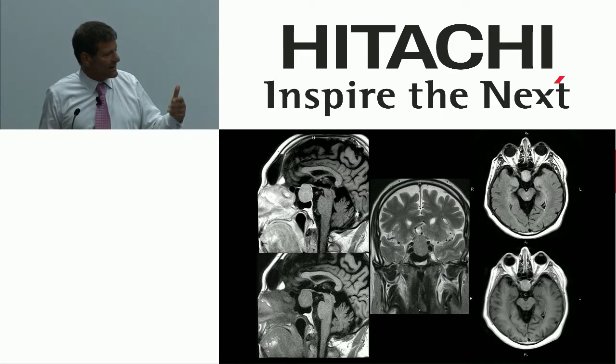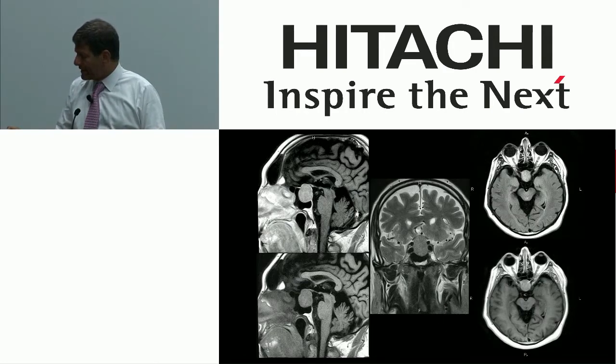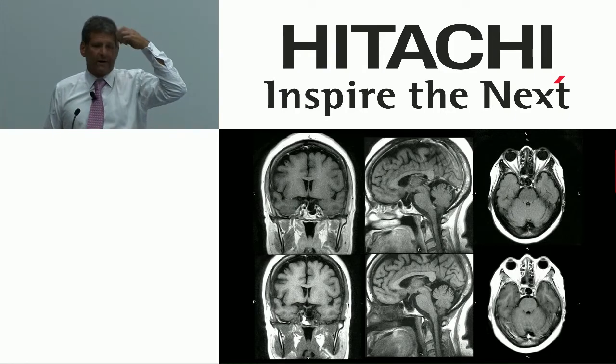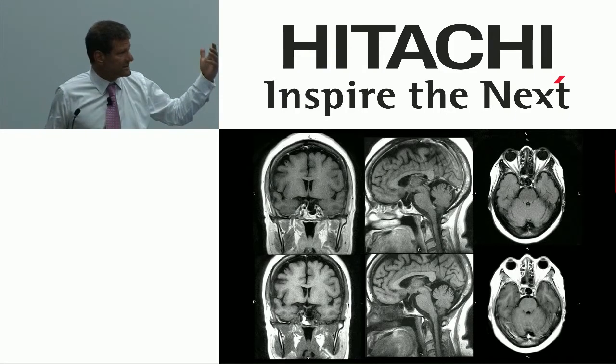definitive exams done for patients who cannot tolerate a traditional system design. There's a macroadenoma. Again, these are routine exams in clinical practice. This is a follow-up resection adenoma. Okay, you've got to follow these patients up. The images have got to be definitive. They can't be, I don't know what I'm looking at here. I can't see what I need to see. I have to see what I need to see.